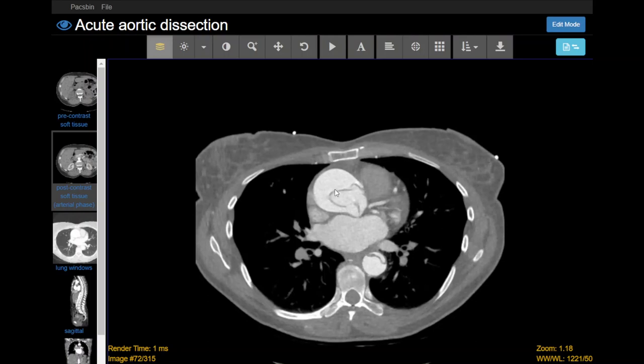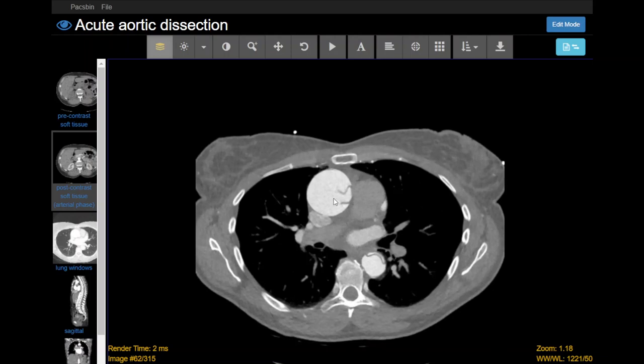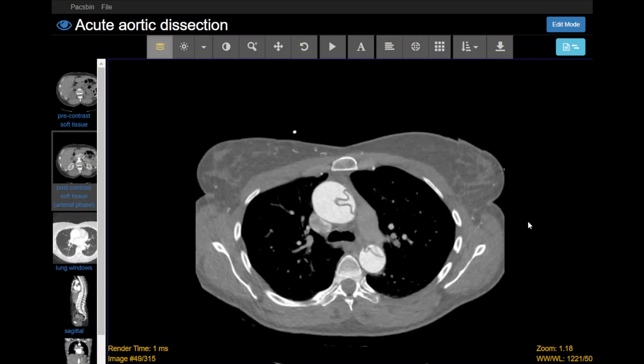Another finding you want to make note of is that the false lumen is opacified with contrast. That implies there's some sort of hole or fenestration between the true and false lumens somewhere. You can see that there's probably a hole right at the base, right at the aortic root, which is allowing the contrast to get in there. Sometimes the false lumen will not opacify very well. So that's another thing you want to make note of.